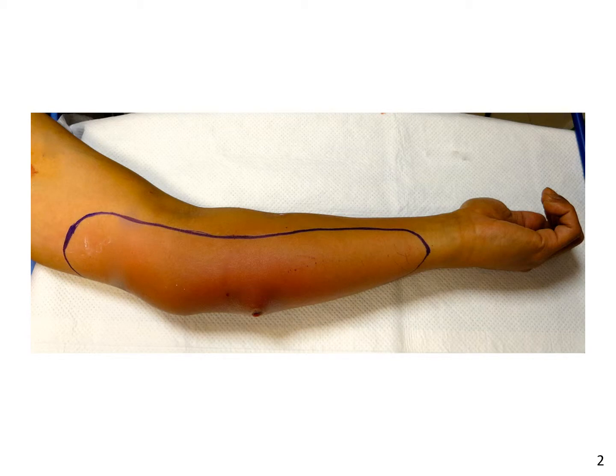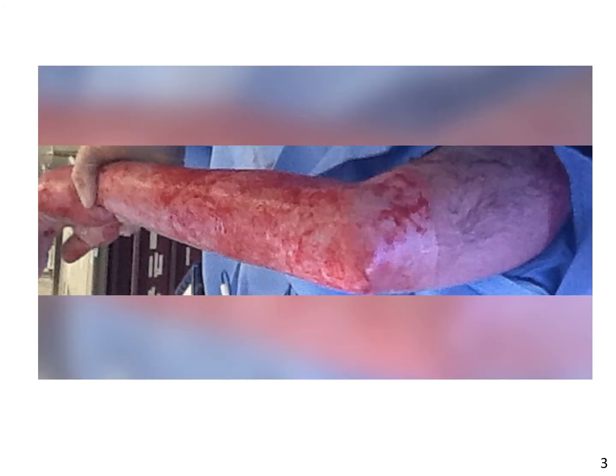These two block techniques are useful for a variety of procedures involving the upper extremity. For example, elbow dislocations or arm abscesses, such as the one shown here, that require extensive incision and drainage. Other procedures like burn wound care can be done without procedural sedation when using these blocks.